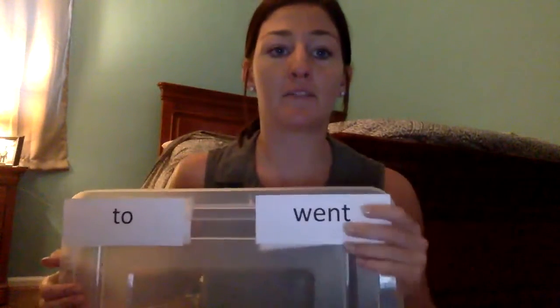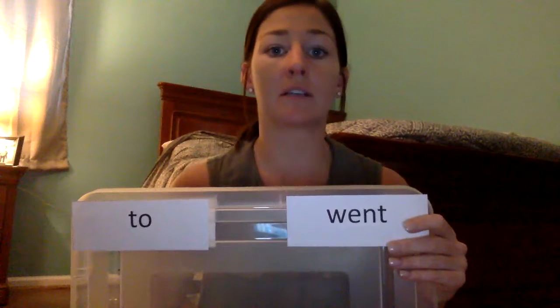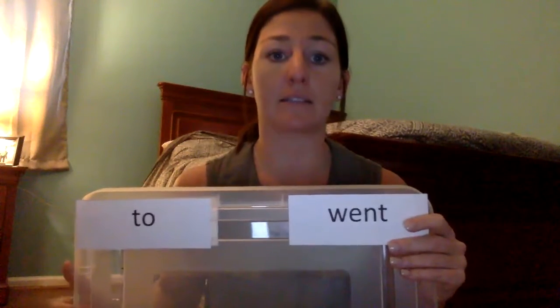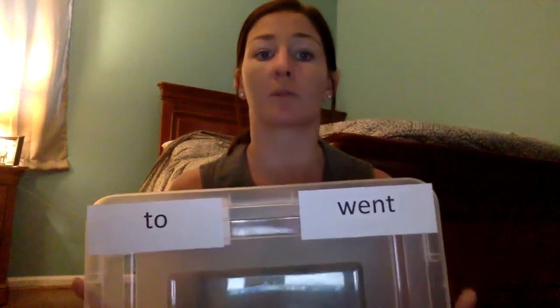My first activity for John is a reading and writing activity. With my assumptions, since John's hands would not allow him to actually write the sentence, this low-tech device would enable him to procedurally write the sentence with the motion of his eyes and head in the direction of each word to formulate the sentence in its correct order.